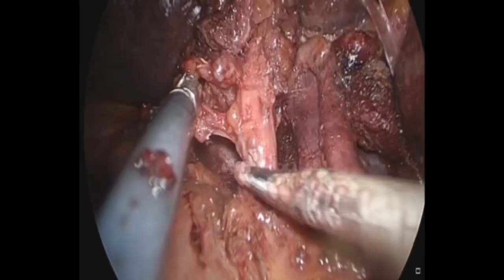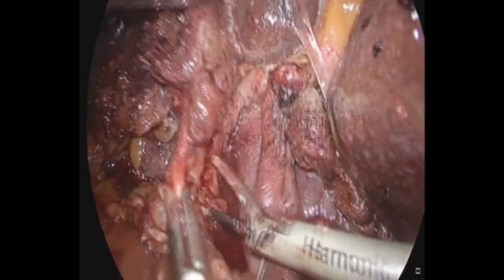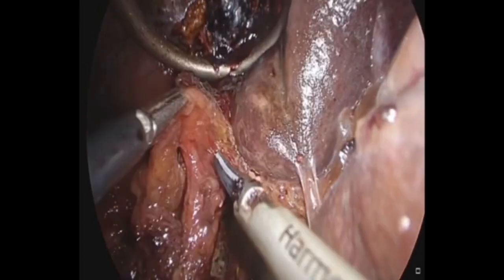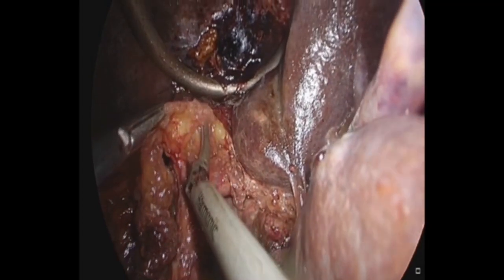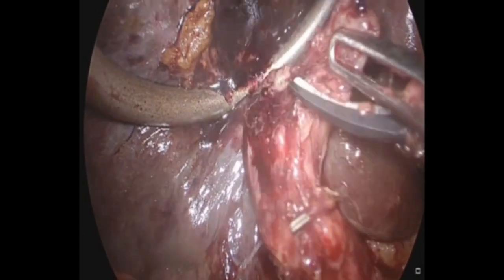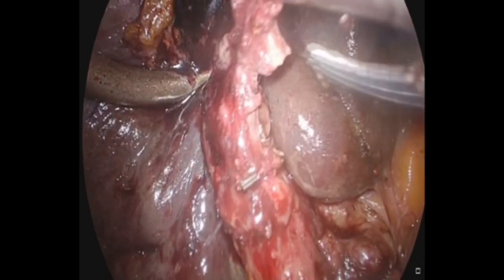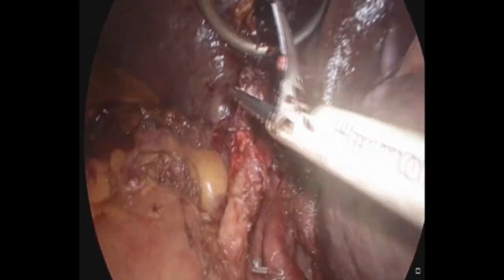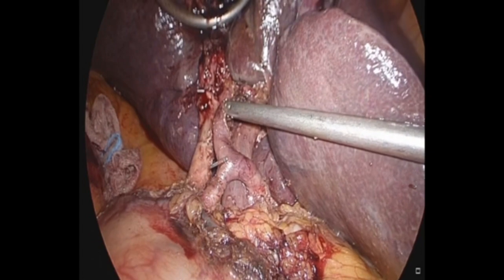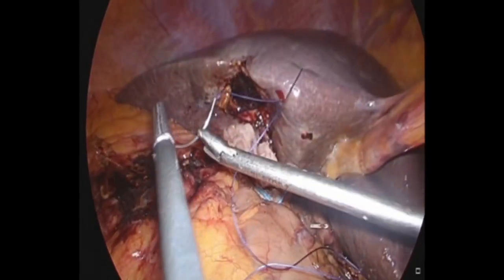The wedge resection of the liver can be either non-anatomic or anatomic. Non-anatomic means remaining two centimeters away from the gallbladder fossa and taking the wedge of liver out. In this situation, because the cystic duct margin was free of tumor, we did not proceed with resection of the extrahepatic portion of the common hepatic duct and common bile duct. The anatomy is well appreciated, and even the portal vein branches can be seen.